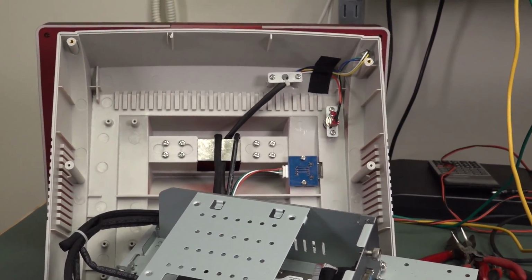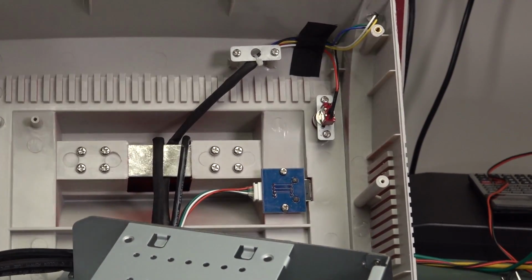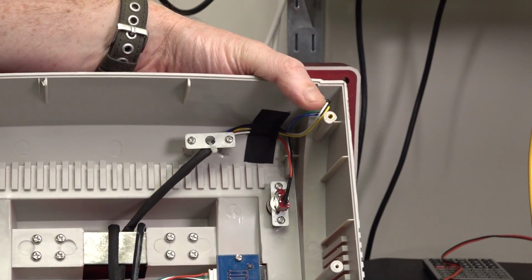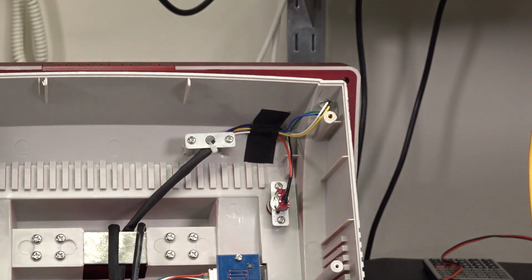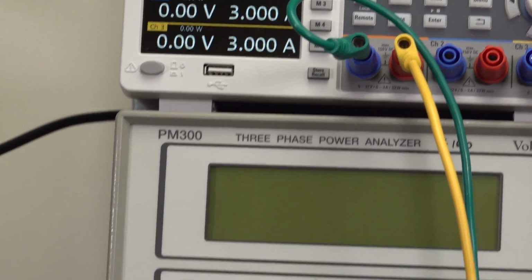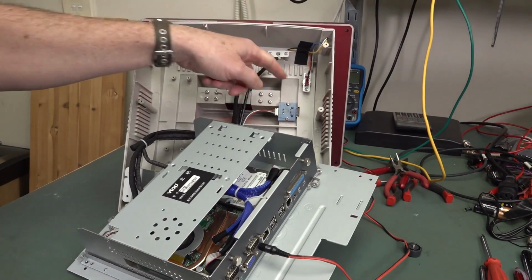There's not much else up in the case. Nothing doing up there, really. There's a switch on the... Oh, is that the power switch? That could be the... I think I found the power switch. Dumbass Dave. The other one was just for the monitor. Oh. Yeah, there you go. You probably can't hear it, but there's a fan. I just started it up. Yeah, 2 amps at 12 volts on one of the inputs there by pressing that button on the top.